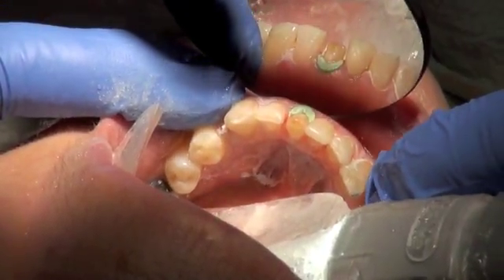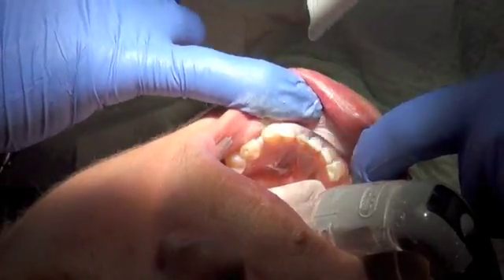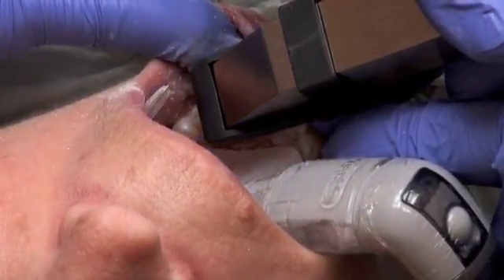A green clay-like material was then used to encourage gentle separation of the gum tissue from the edges of the prepared tooth, so that an exact replica of the prepared tooth could be drawn into the Cerec CAD-CAM machine.